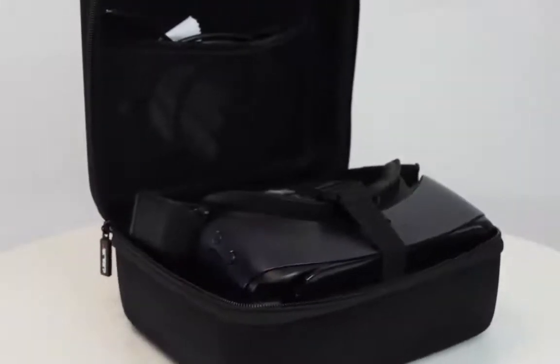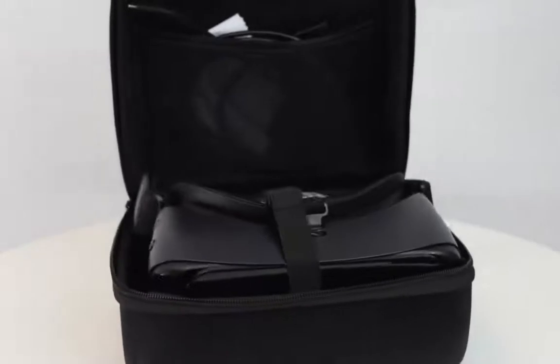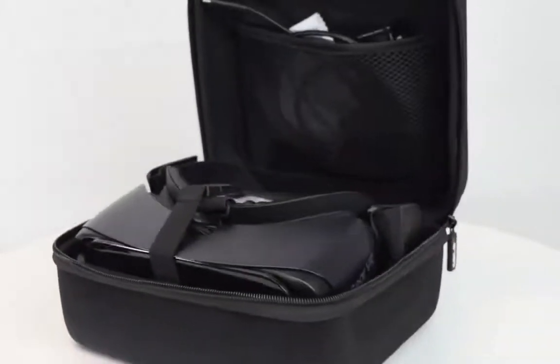The VF2000 comes in a convenient, portable carrying case, able to be carried securely between areas in your office or off-site locations.